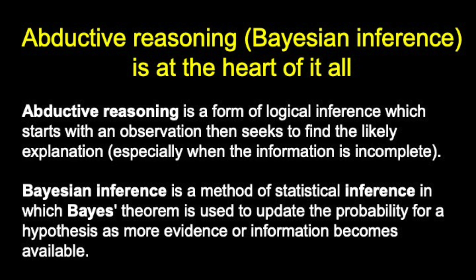So I'm going to come closer. If I still can't figure it out, I will touch the lesion. I may take out a magnifying glass. I may do side lighting. It's all this added information that's providing me with data that will eventually lead me to know what this lesion is, or at least what I should do with this lesion. Dermoscopy is the same thing. It fits into this wheel, and with this added information makes you better in your diagnostic accuracy.